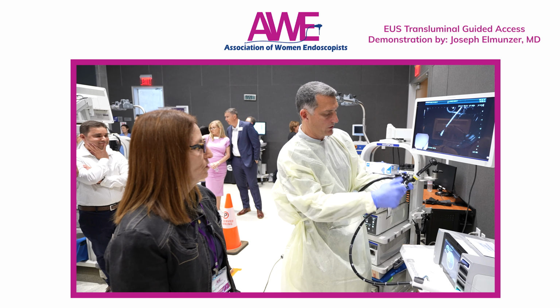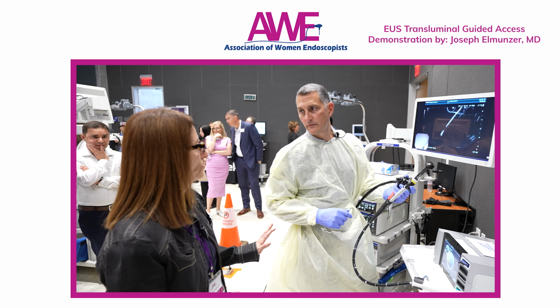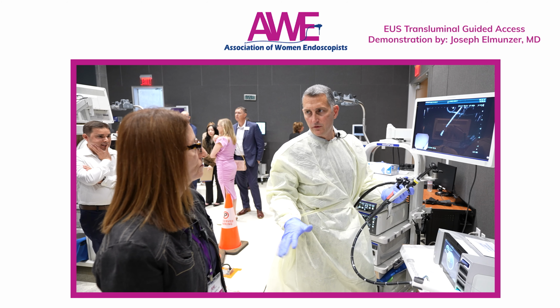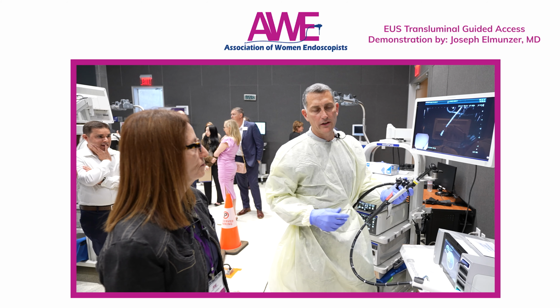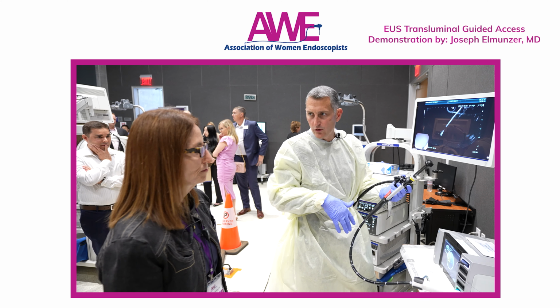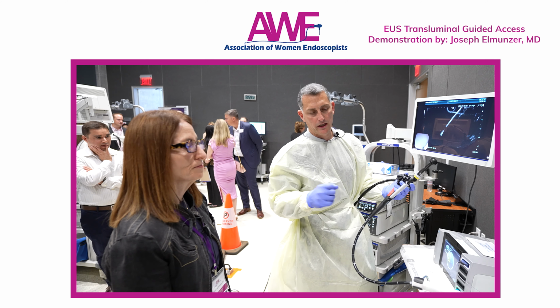So Joe, what are the specific cases that you might consider using a wire in? I think a wire is always going to be helpful because typically you're going to dilate the lumen. For example, in a pancreatic fluid collection drainage, I typically preload with a wire, burn through, and then advance the wire, coil it, and then dilate.